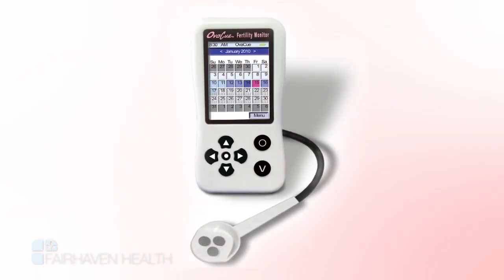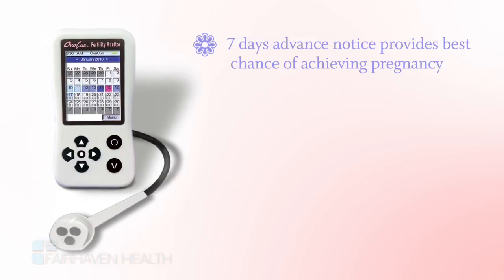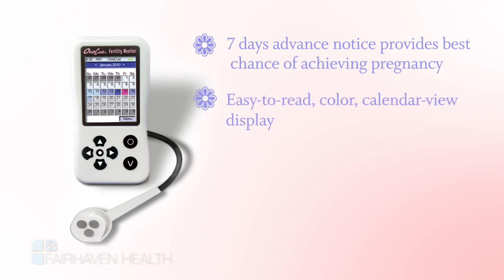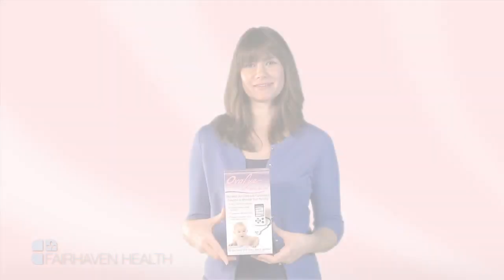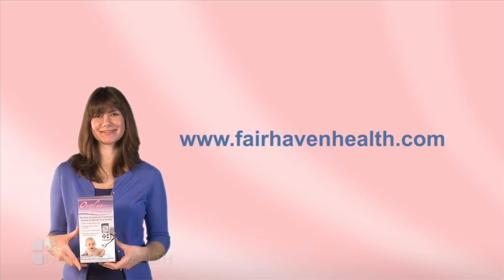The OvaCue is the easiest, most convenient, accurate fertility monitor available. With the OvaCue, you get the greatest advance notice of your ovulation date, providing you with the best opportunity to achieve pregnancy. An easy-to-interpret, color-coded calendar display shows your most fertile days. Saliva-based testing means no messy urine tests or additional purchases required. The highest degree of accuracy — over 98% — recommended by fertility specialists. To purchase the OvaCue Fertility Monitor or to see all of our trying-to-conceive products, please visit us at www.fairhavenhealth.com.